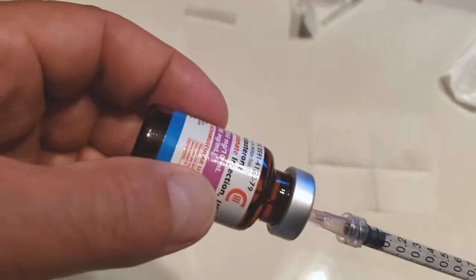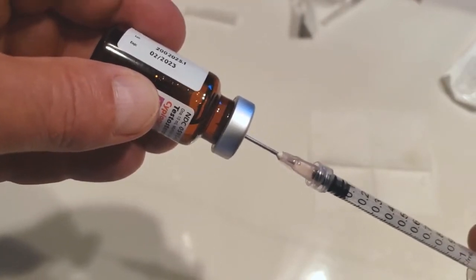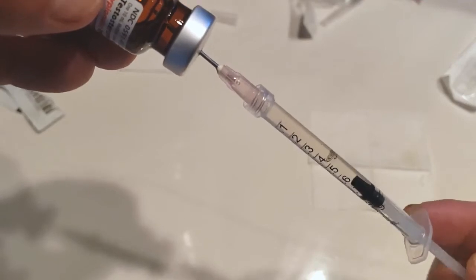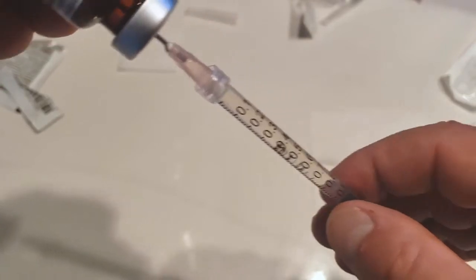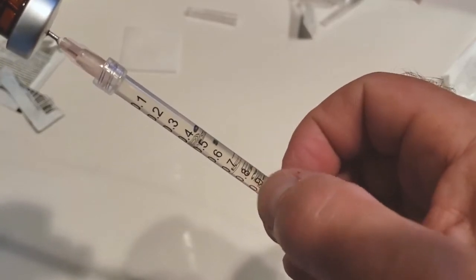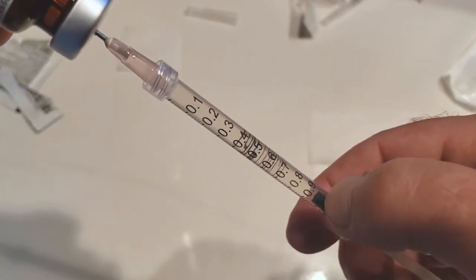Move the bevel of the needle down into the fluid by backing it out just a little bit. Now withdraw the plunger of the syringe and bring in the viscous yellow-appearing fluid medicine, pulling all the way down to full. We want to put 0.8 ml in, so find the 0.8 ml marker and set the base of the hub to 0.8.